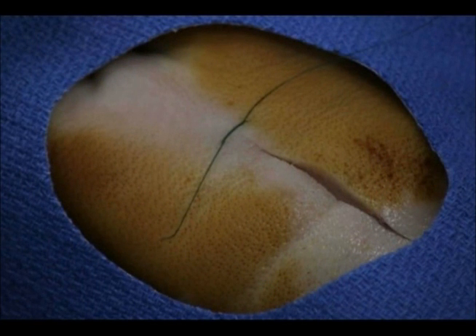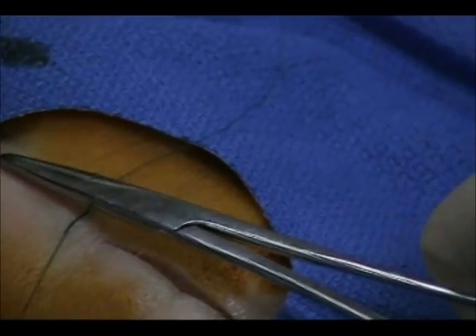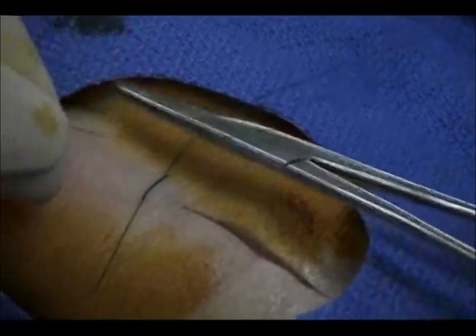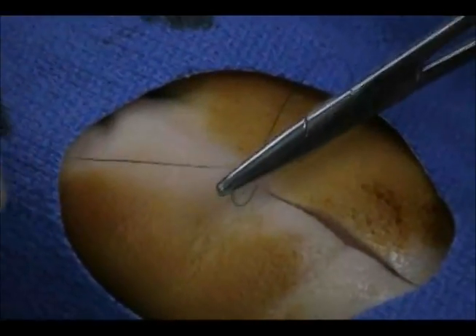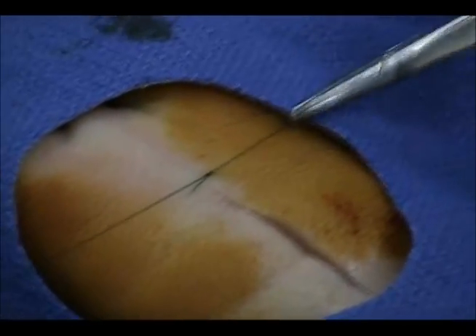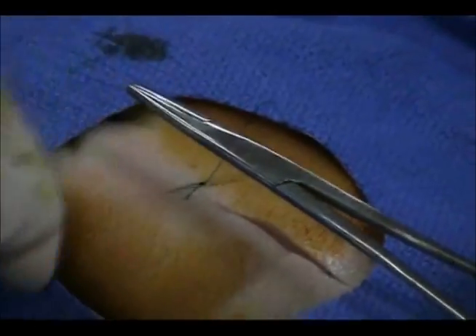Alternating single throw ties should subsequently be performed to prevent knot slippage. To do this, again position the needle driver over the wound between the two suture tails. This time, the short and long tails have swapped from their original position. Wrap the long tail around the needle driver only once and use the driver to grasp the short tail. Pull the short tail through the single loop so that it is now positioned in its original location. Continue this for several throws while being careful not to make air knots.